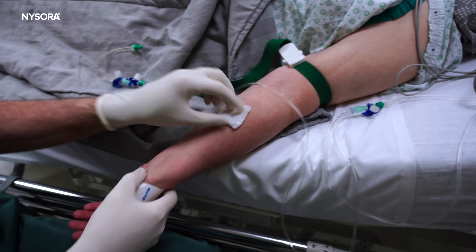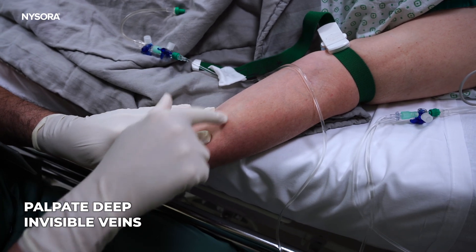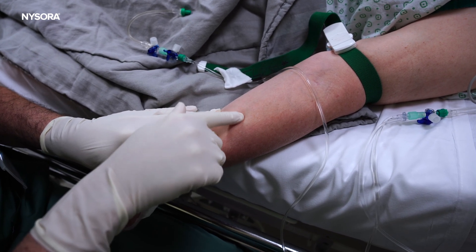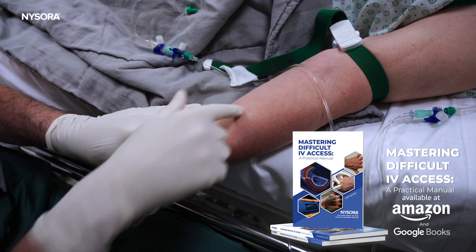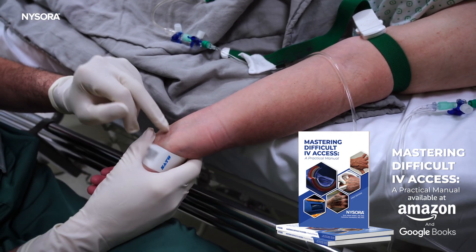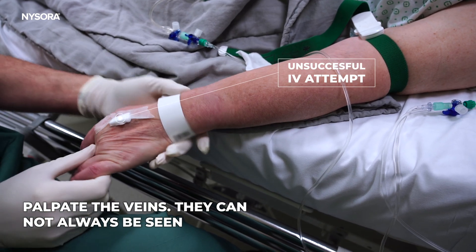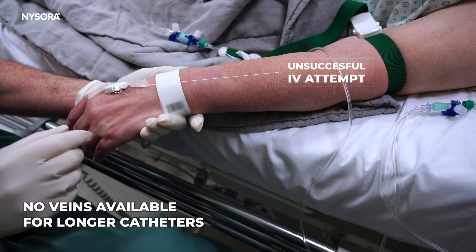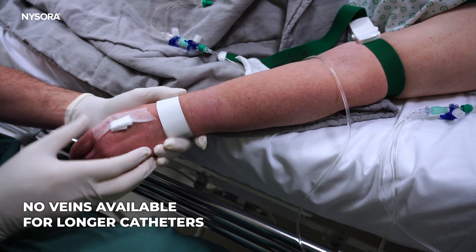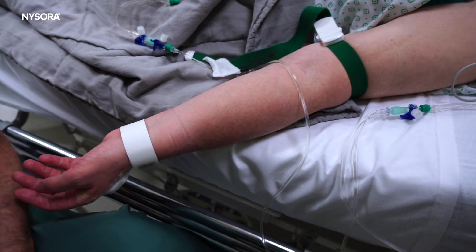What we have here when we examine this — there's a deep vein over here that I can feel. We cannot see it, but I can feel it and it's well filled. That's probably the best bet because the others here are a bit small and branching. Here they had an unsuccessful attempt, as you can see. There are really not nice veins to place a lengthy catheter for this operation, so we're going to use a deeper vein, or try at least.